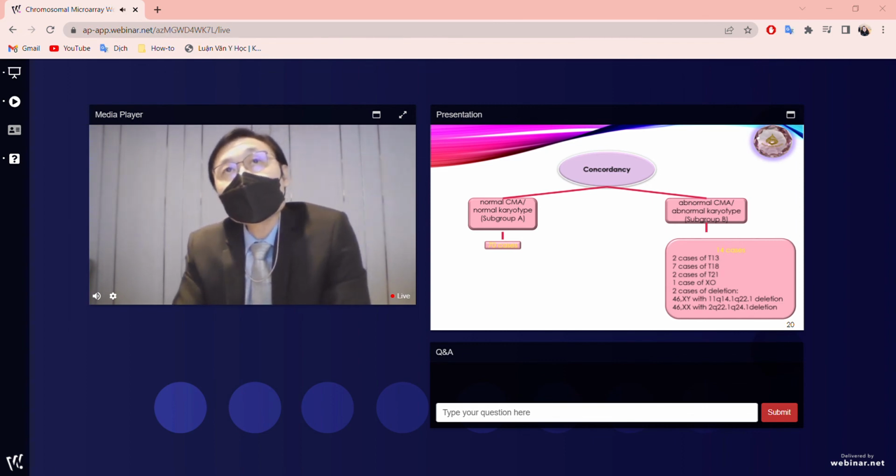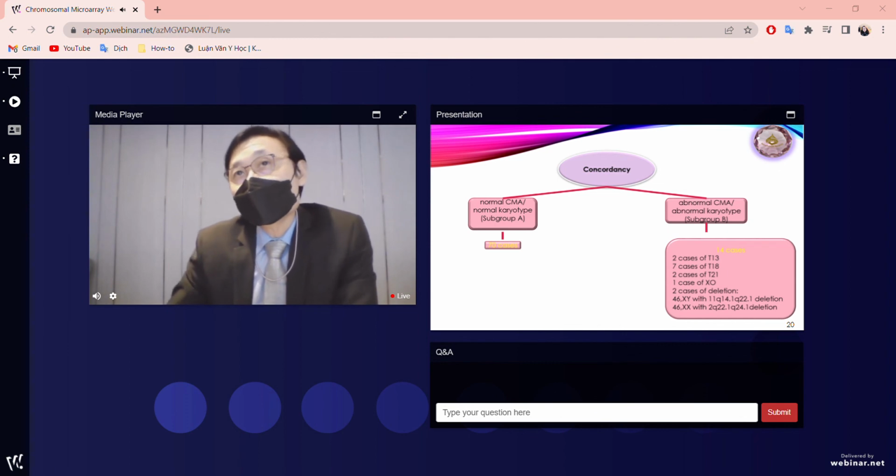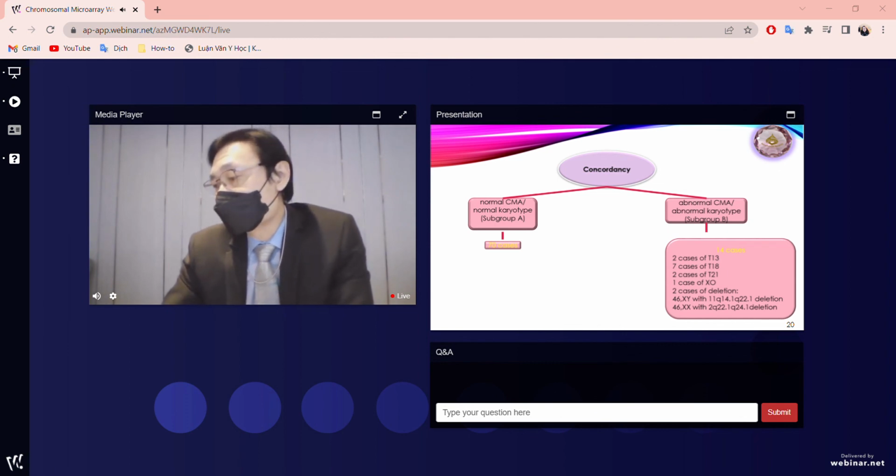Then let's focus on the concordant group. Subgroup A consists of 70 cases with normal CMA and normal karyotype. Subgroup B consists of 14 cases with abnormal CMA and abnormal karyotype. Most of them are trisomies. Interestingly, we got 2 cases of deletion.